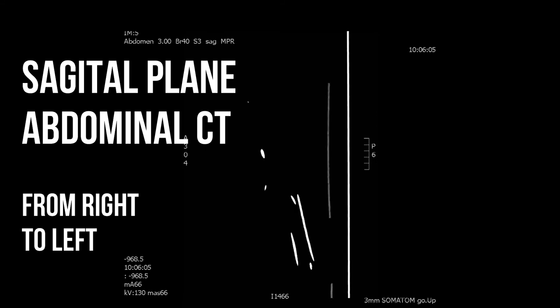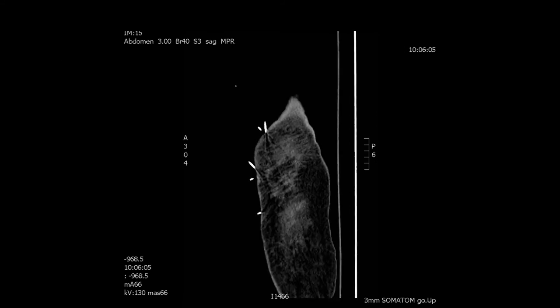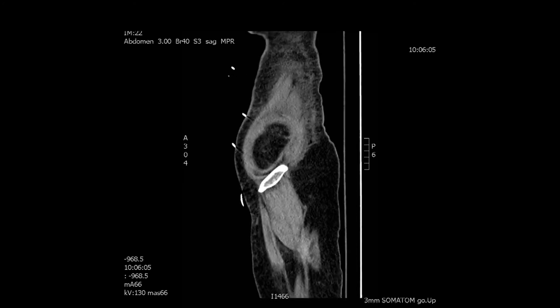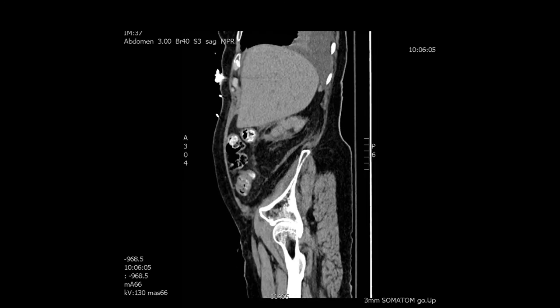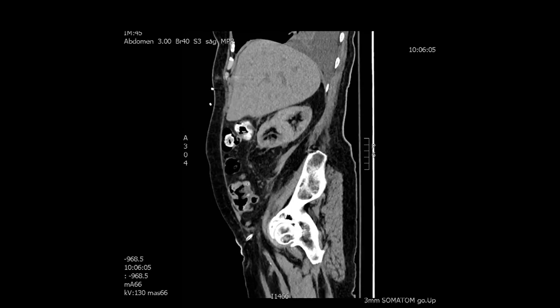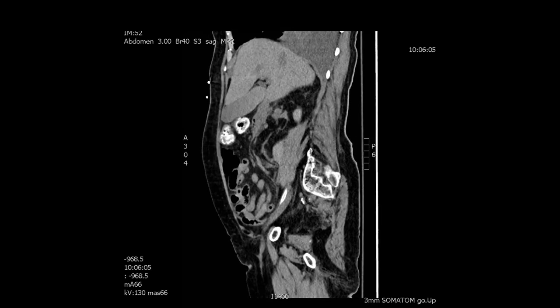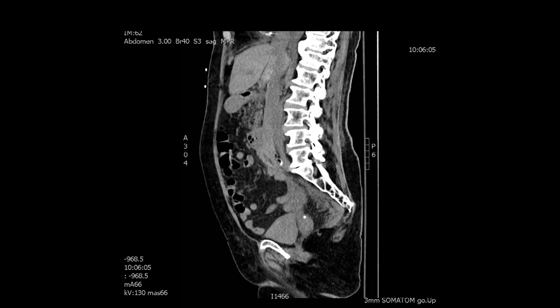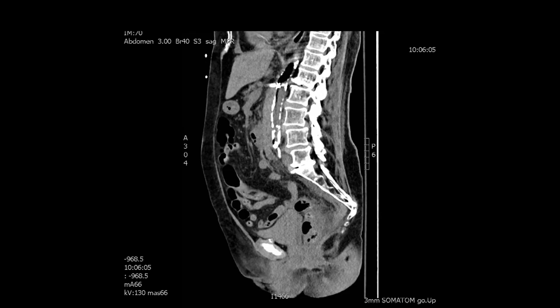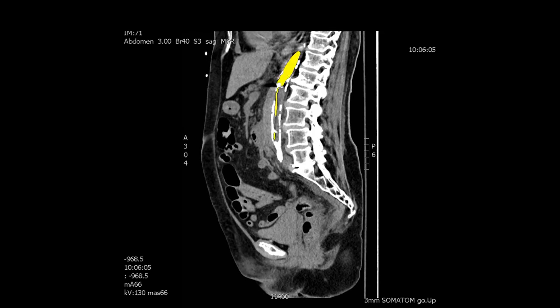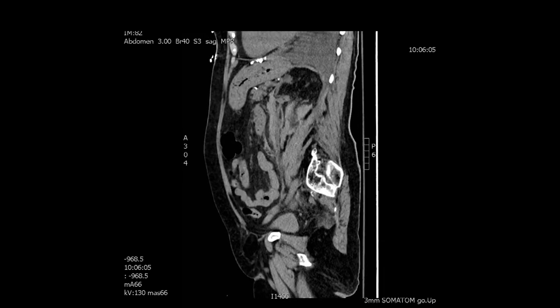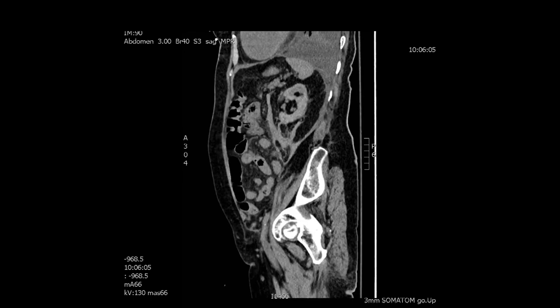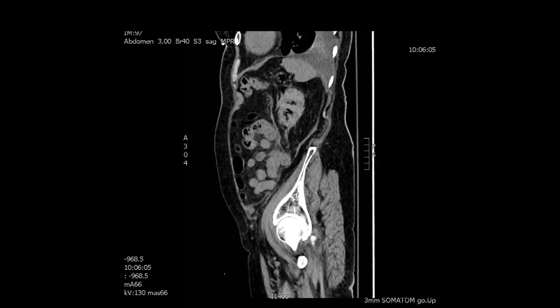Next we'll do the sagittal plane of the abdominal CT from right to left. We'll see the liver first coming into view at the top, then the abdominal contents, the kidney under the liver. Then we'll see the cava and the spine, and then the aorta comes into view. In yellow, the area of the balloon pump inflated is depicted. We then continue to the left portion of the abdominal cavity, with the left pelvis and femur coming into view.